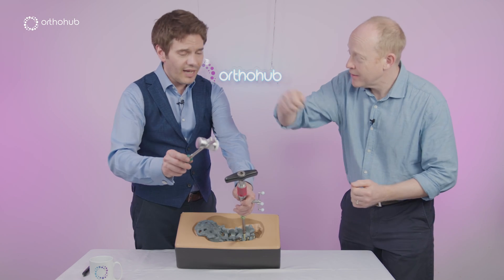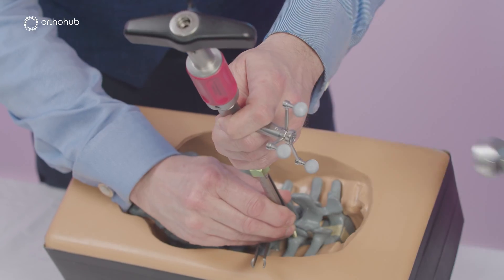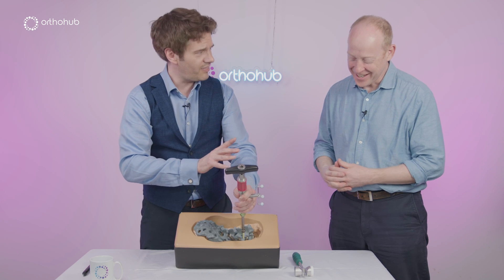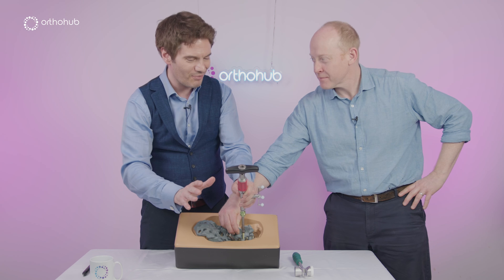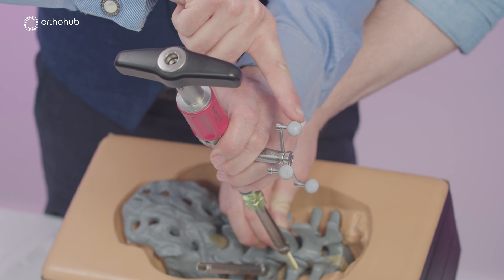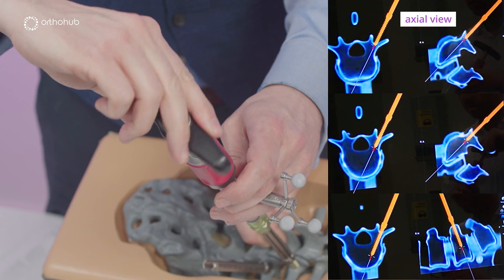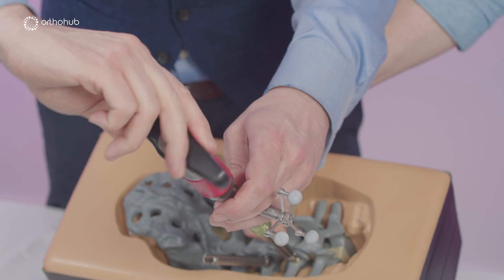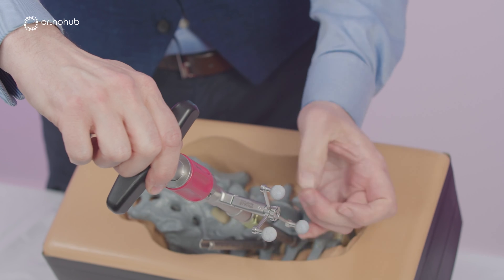We place the screw through the skin incision down to the start point, visible on the navigation system. As long as the camera can see the three points on the reference array, we're good to go. Tap — not whack — through the cortex; we've advanced the stilette to the five-millimetre point. No lateral or AP fluoro needed — we can see on navigation where we are. As we advance the screw, as long as the reference array is seen by the camera, we can see on the axial exactly where it's going — that's the holy grail of navigation. We can see it live, right down into position, then simply undo and away.